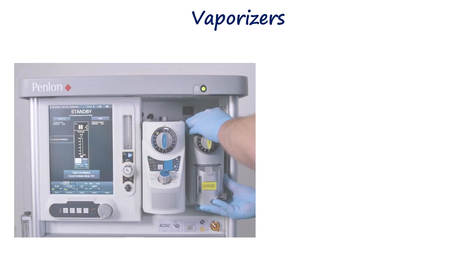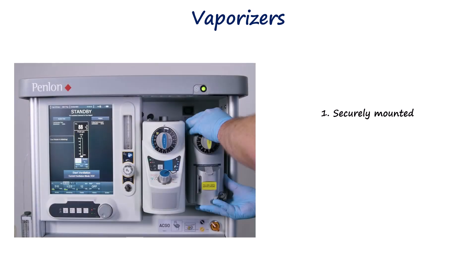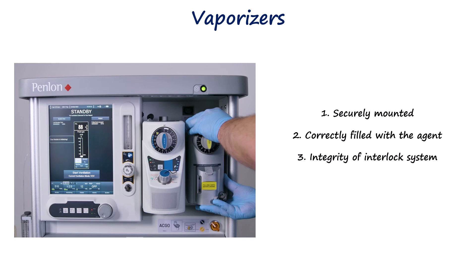Vaporizers should be mounted securely and upright. The correct agent must be loaded and the fill level verified. Interlocks must function properly, preventing simultaneous activation of multiple vaporizers. The control dial should be rotated through its full range and returned to zero to ensure smooth operation.